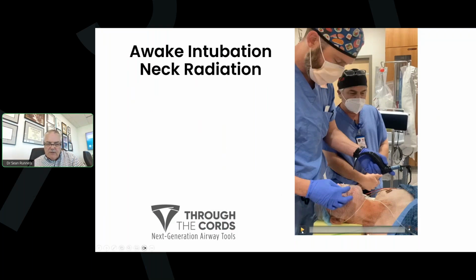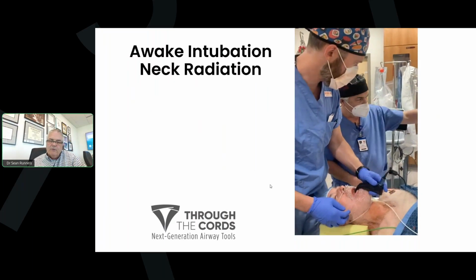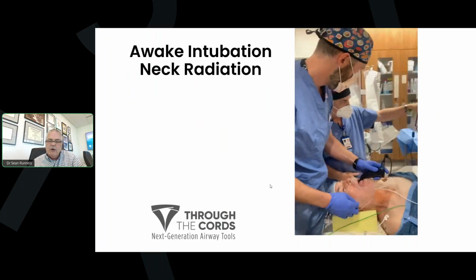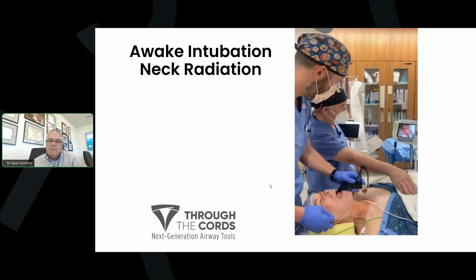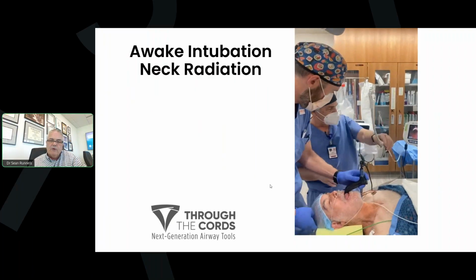I'm going to see if I can run this in little clips so I can talk about the device. So the video laryngoscope is placed. The patients are not bothered by a video laryngoscope when they're numb because it fits their primary curve.